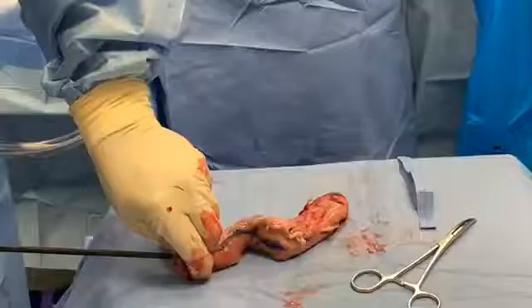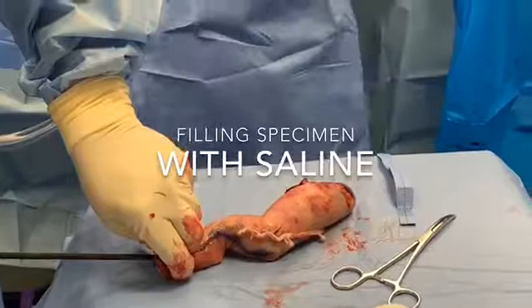Here we demonstrate the capacity of the resected stomach by filling it with saline.